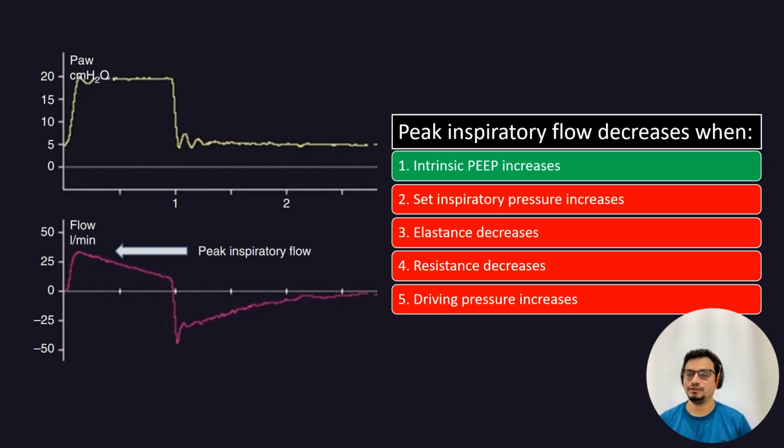All right. I have not gone into detail of each variable so much. I have created this video just to give you a quick and factual interpretation of each option one by one, and I hope that this video will benefit all of you.